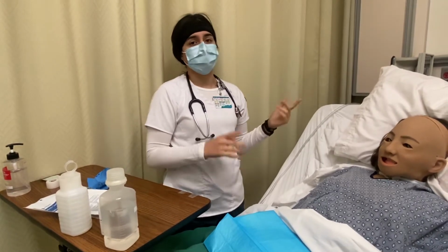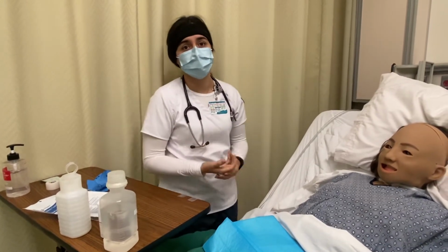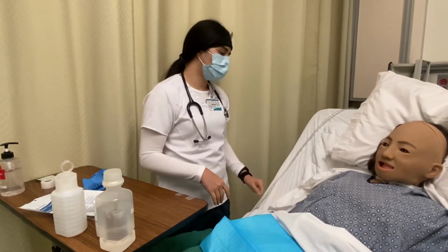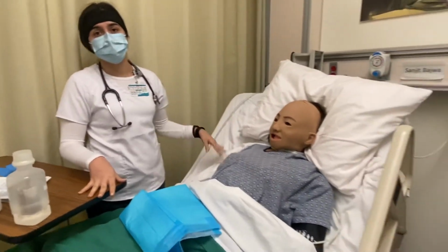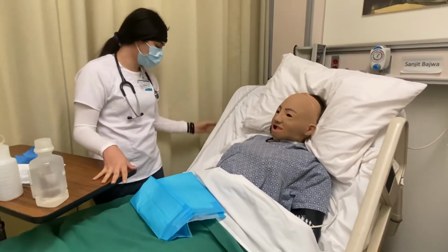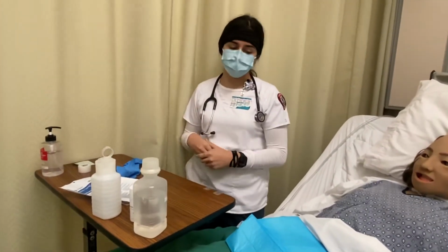I'm also going to check my surroundings, that the patient's name is on the board, and the wristband as well. So you double check, or triple check, that this is the right patient. Then I would put the patient in a high Fowler's position, which I already did. I'd put the bed rail down on one side, and then put on regular gloves for this.